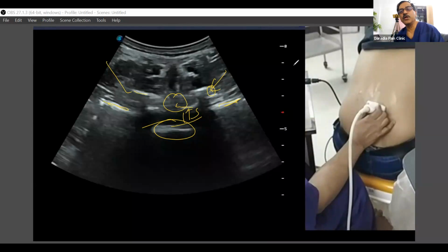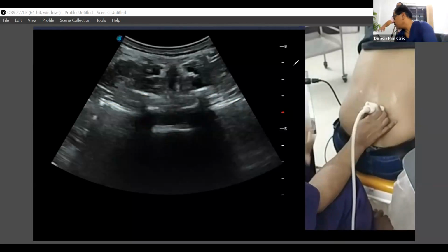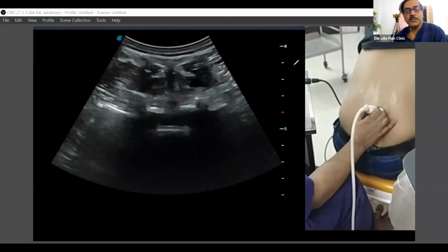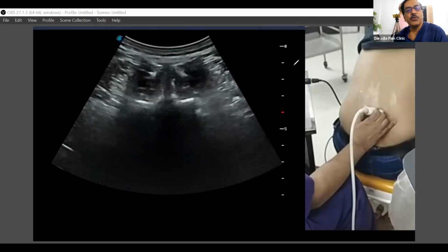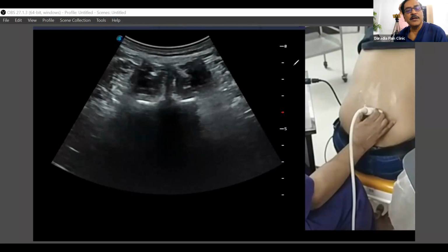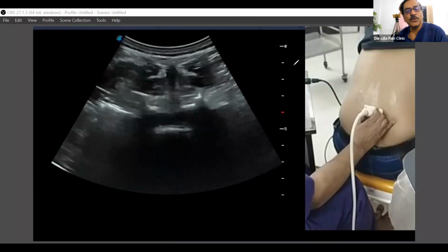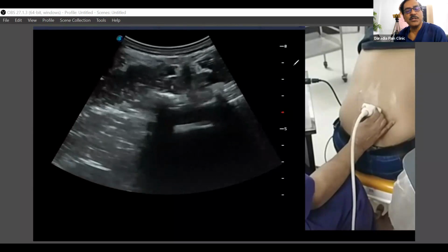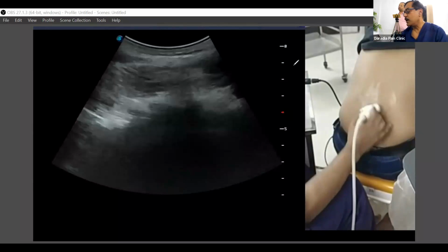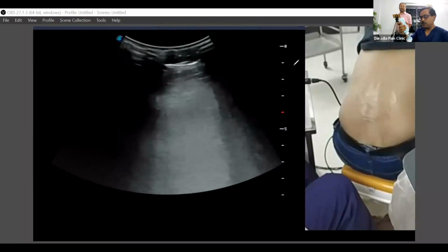So this is when we are peeping, looking through between the two spinous processes. Again, I'm showing you, this is over the spinous process. Here you can't see anything inside. And if I come in between two, then what is happening? We are able to see. And over the transverse process, if you search minutely, you'll be able to see one artery, which is accompanying your medial branch.